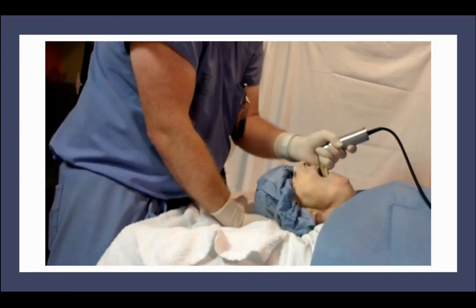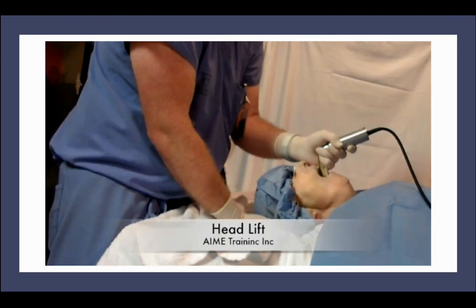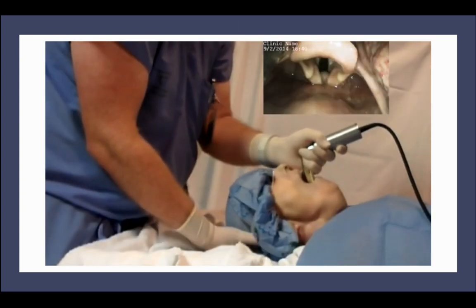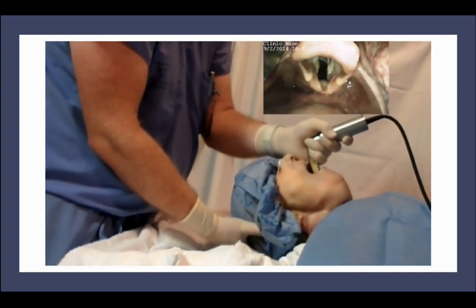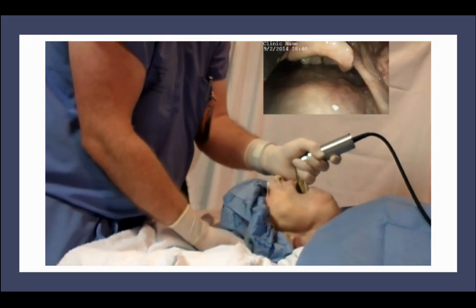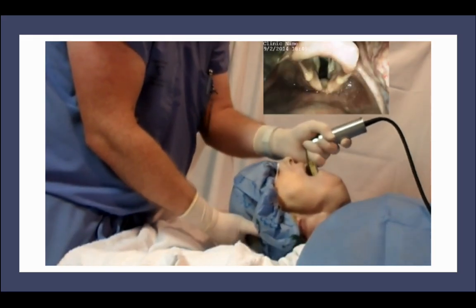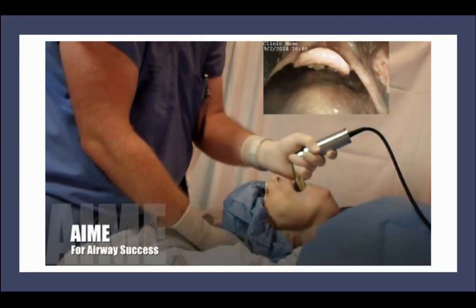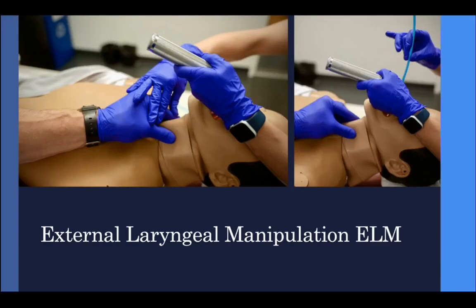This will create a better straight line of sight by displacing the jaw, and it will bring that airway more into view. Here's a video that looks at what we're seeing when we lift the occiput up further versus laying the occiput flat. So a nice head lift can really improve our laryngeal opening. This is a great technique and a great way to practice airway management, is to have a partner or your own hand lifting the patient's head as you're walking down the airway.